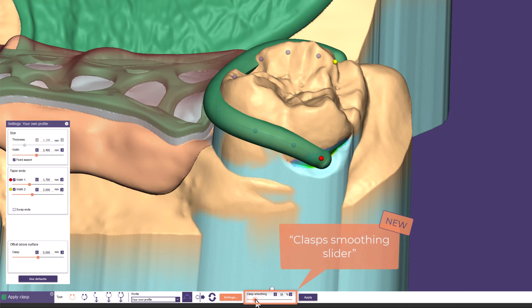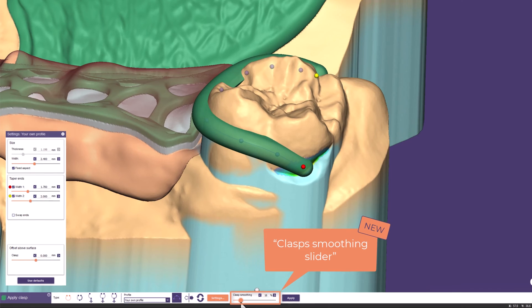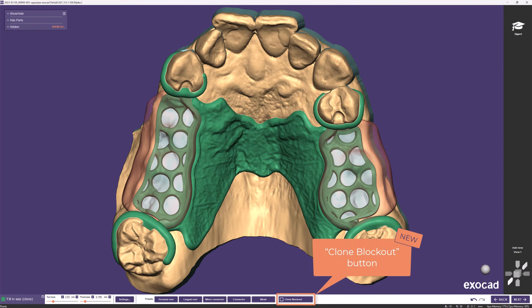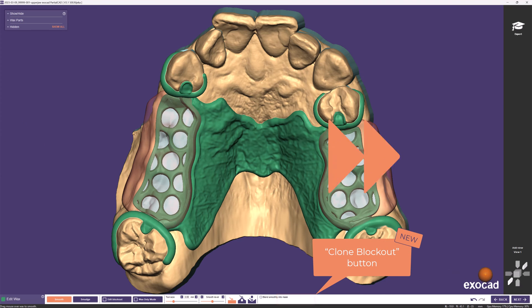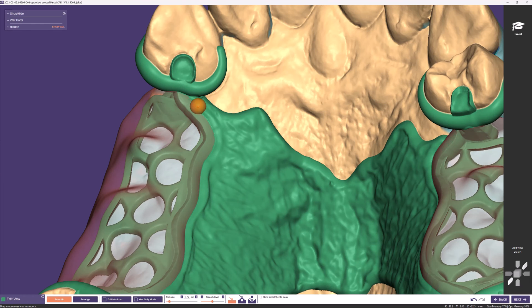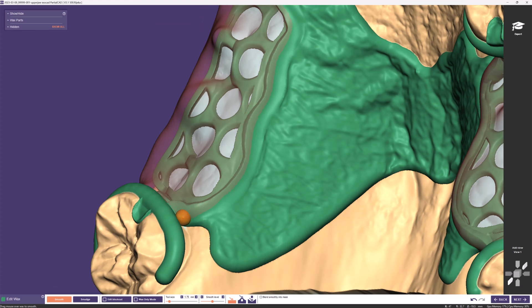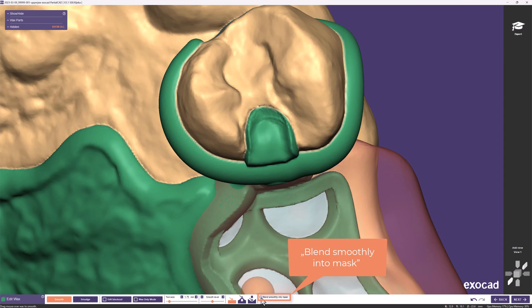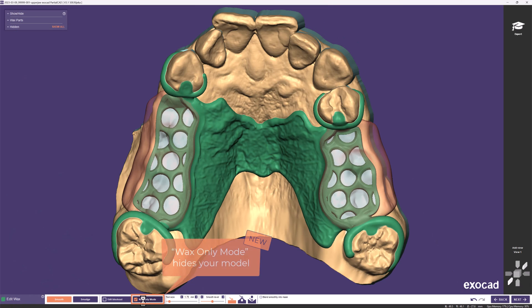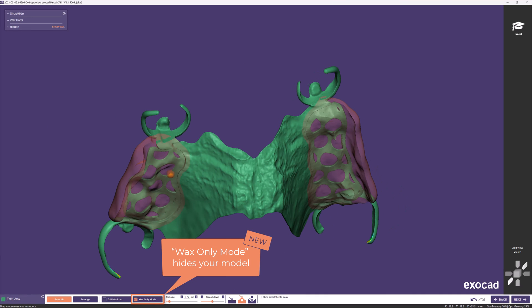Using the clasp smoothing slider, you decide how straight or smooth the clasp follows the refractory surface. The clone tool now contains a Clone Blockout button at the bottom to change your blockout model before applying material. As always in the Edit Wax step, we can smooth transitions to the finish line. For the occlusal rest, I recommend activating the checkbox Blend Smoothly Into Mask. If you activate Wax Only Mode, your model is hidden and you can edit your framework even from the bottom.